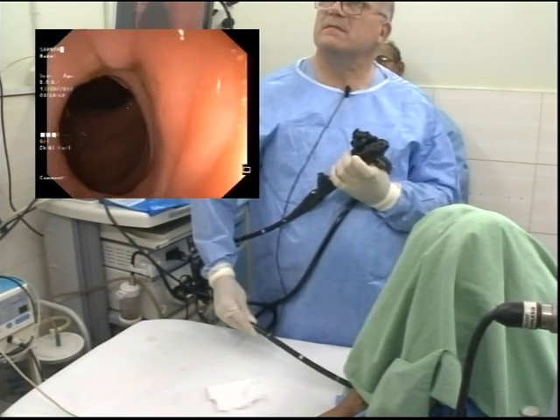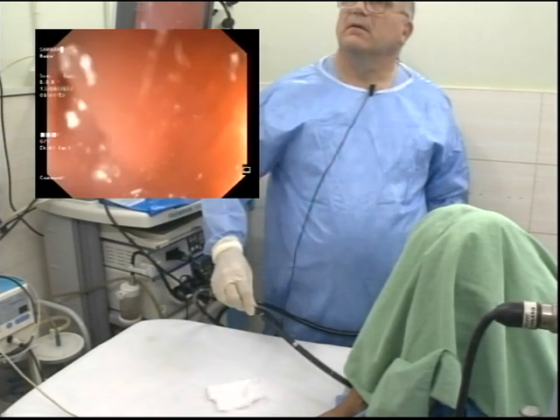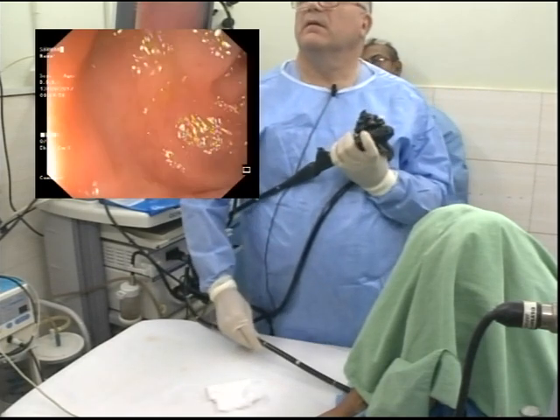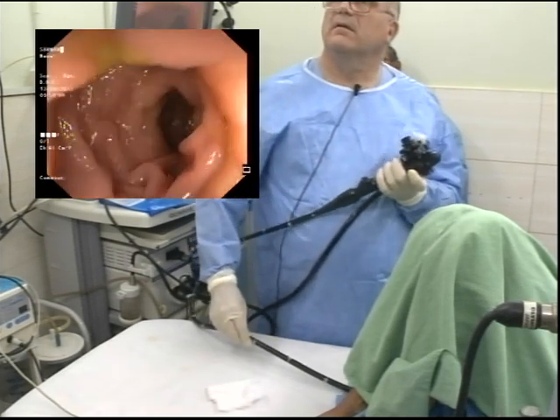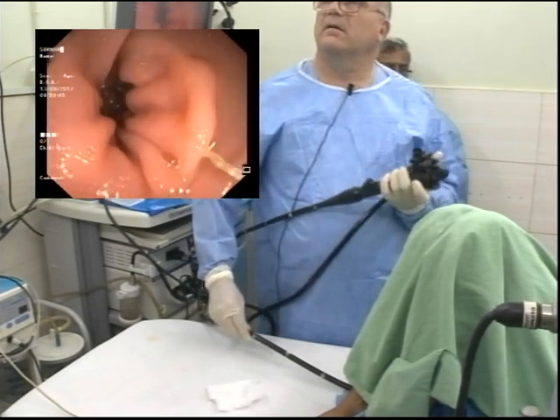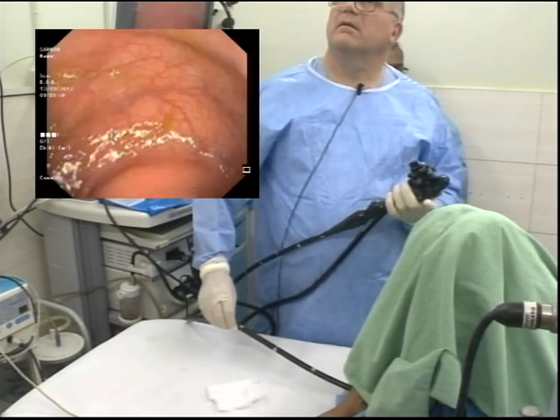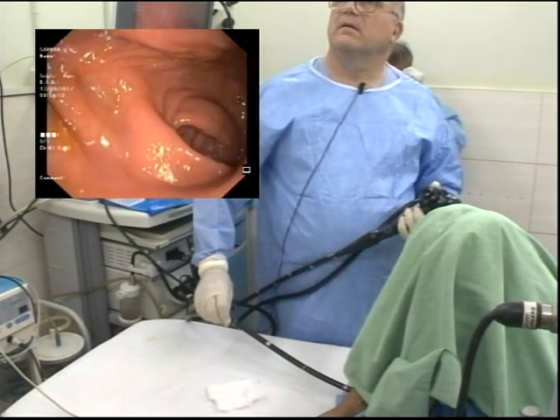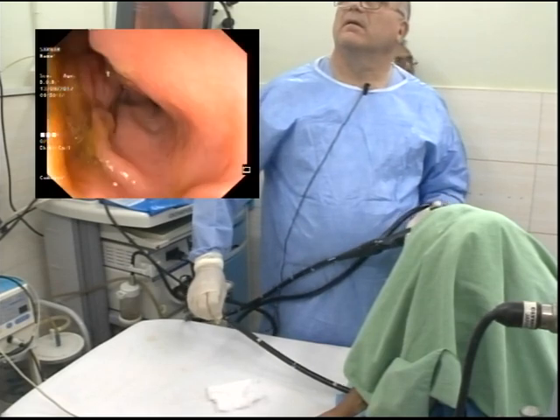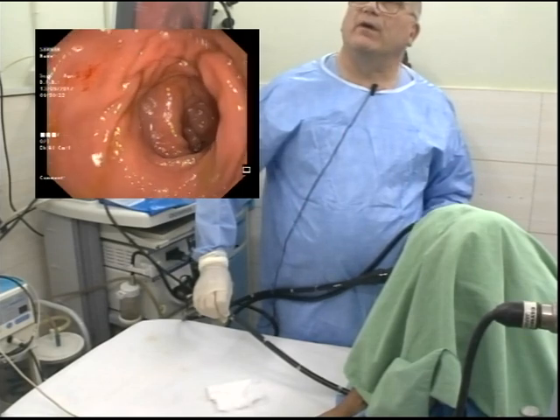Also, when you've used phosphate-based bowel preps, quite often you would see small, very tiny aphthae, especially in the distal colon, left side, rectum. You'll see a few, and that's not inflammation, that's prep related, and it's very different from anything else. If you're not sure, biopsying is never harmful, but once you've seen enough, you'd know that this is nothing to worry about. It's like the stomach, everybody gets gastritis. So we know where we've retroverted, can you see?